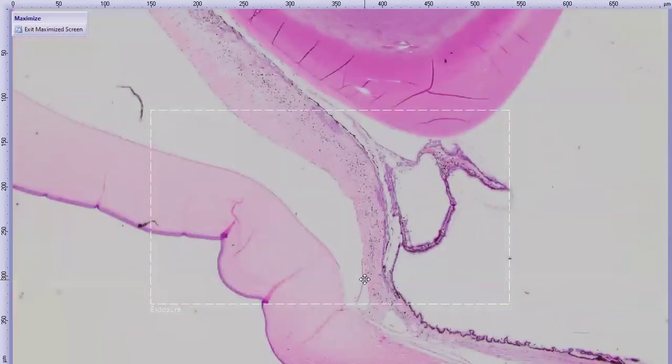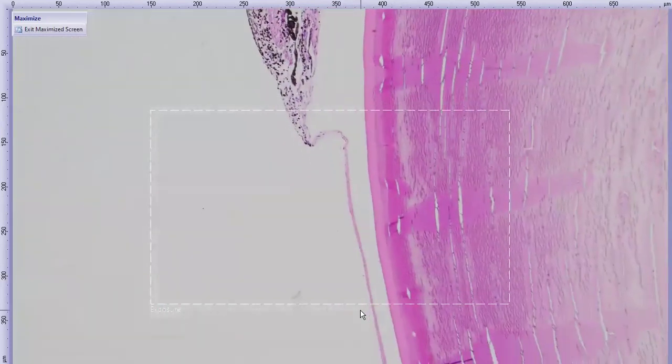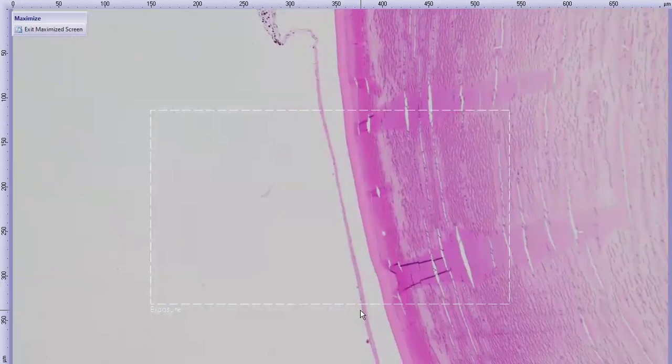Now let's walk back up here for some cleanup stuff. And for that cleanup stuff, note that we have this membrane extending from the iris leaflets onto the posterior iris and anterior lens. There's a little bit of artifactual attachment, but ultimately these iris leaflets were fused to the anterior lens. We've got posterior synechia. And if we walk ourselves to the back of the lens, there is posterior migration of the lens epithelium. We shouldn't see lens epithelial cells back here. And there's a little bit of hypertrophy and hyperplasia as well.